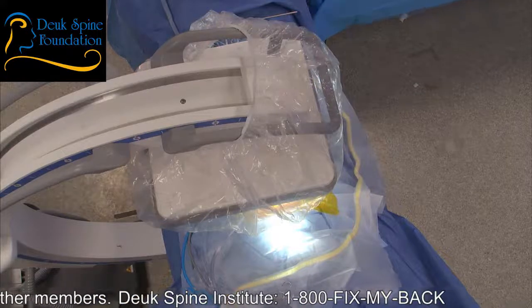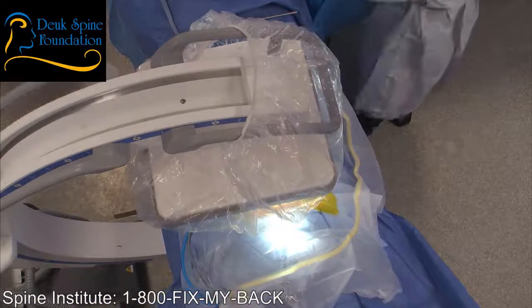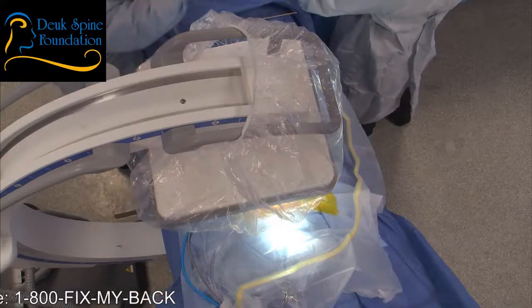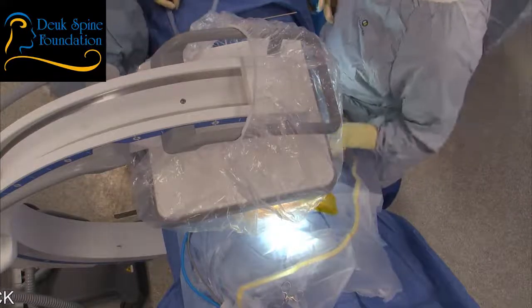So he's got two herniated discs, L4-5, L5-S1, and he has something called a pseudo disc, which is a fake disc at S1 and S2. So I need to know that because I use X-ray to guide to the discs that need to be fixed, and we got to know about the fake disc because that's going to be seen on the X-ray usually.